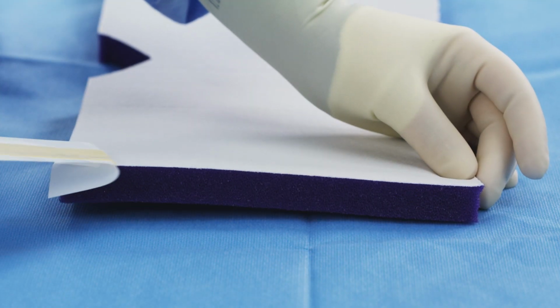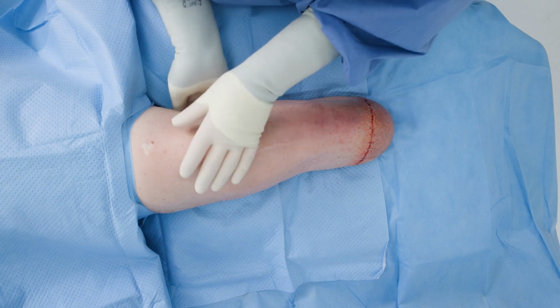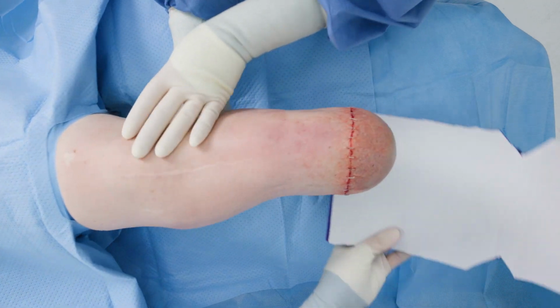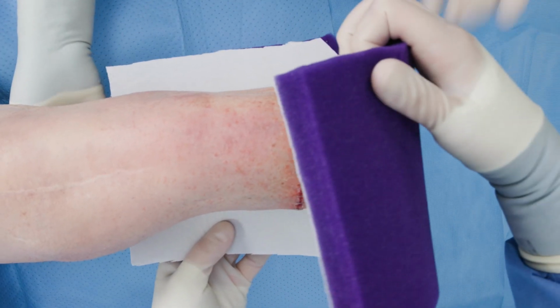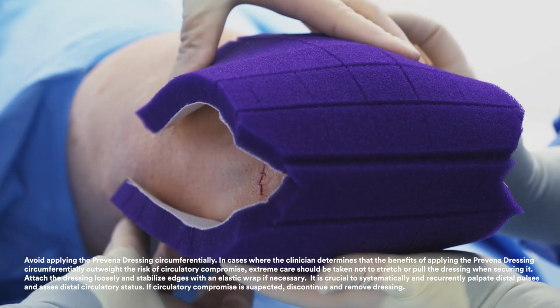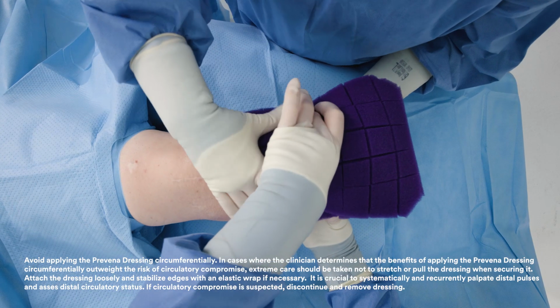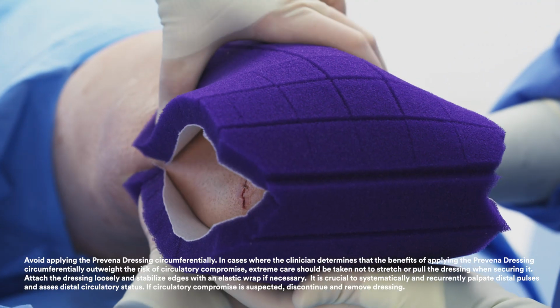For a larger leg, start with a wider piece of foam. If possible, have another clinician stabilize the limb. Hold the cut foam in place over the incision, assuring there is a gap on the sides of the foam to avoid circumferential application. When centering the dressing over the incision, ensure none of the sealing strips are touching the incision.